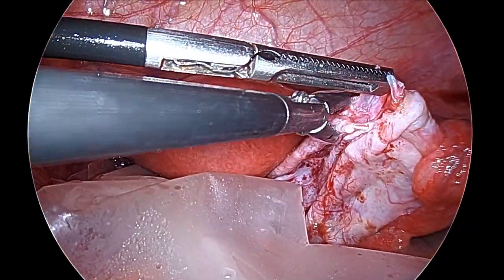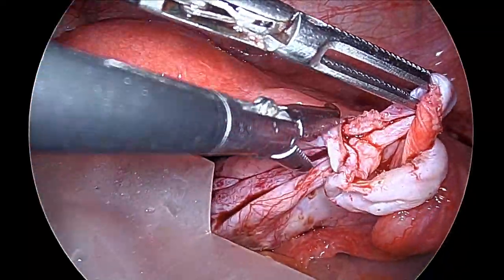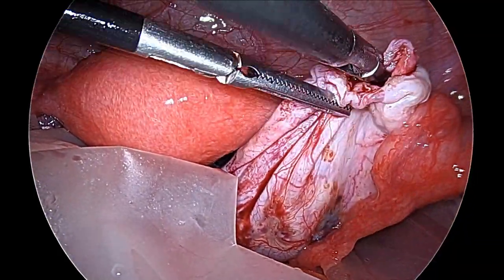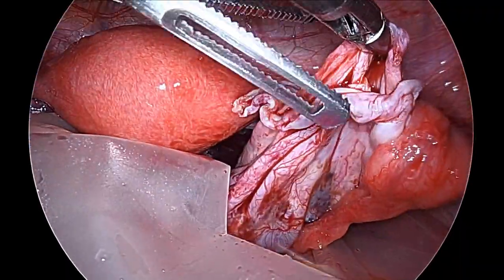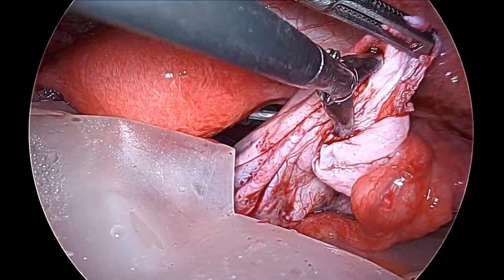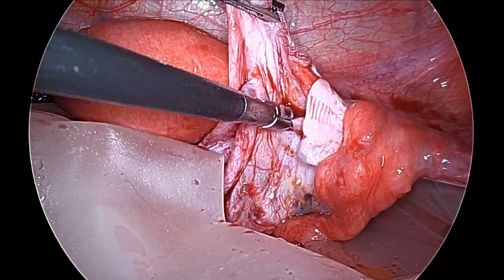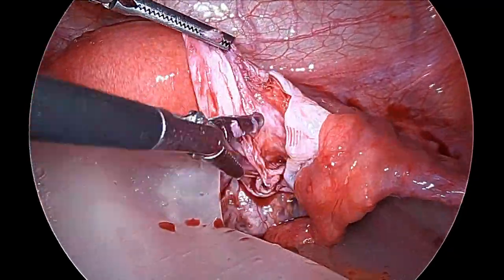Slowly, stripping of the cyst is started — bilaterally, symmetrically, and equally all around. Sometimes the left hand holds the cystic wall while the right strips the ovarian cortex, and sometimes vice versa, so you need ambidexterity. In a simple cyst, taking the cystic wall is not difficult — it is very easy. You should try to strip equally all around; going too far on one side can cause tearing.